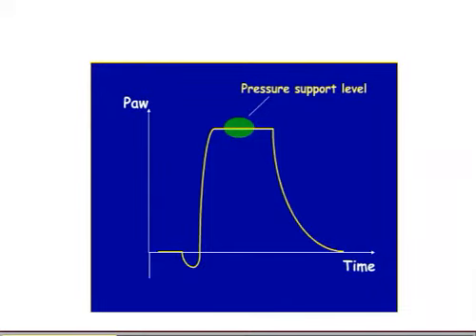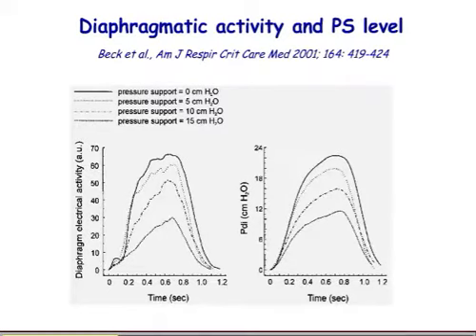Now, if we look at the level of pressure support, there are several studies which show the results that I'm showing you here.